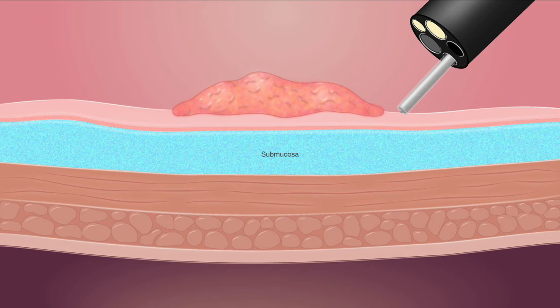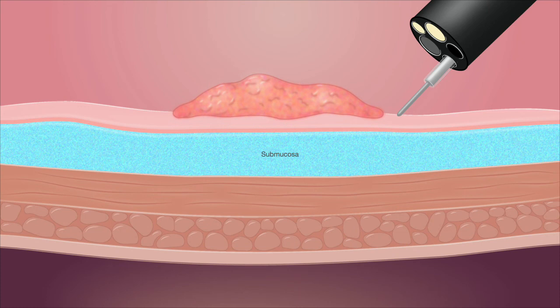The endoscopist has pushed the catheter through the biopsy channel and it has come out into the field. And once it's out in the field, he will ask you and say needle out. That means you pull the sheath back and the needle comes out.